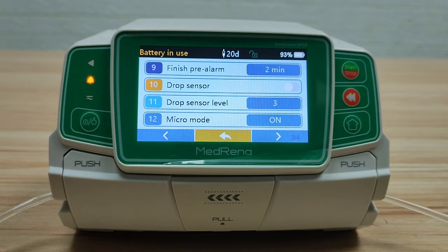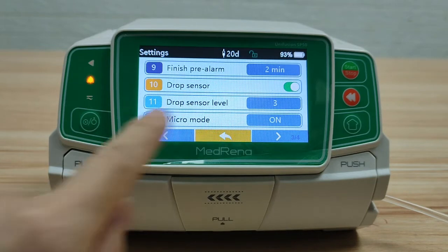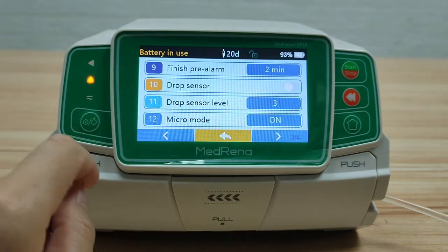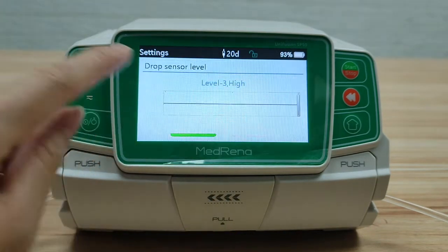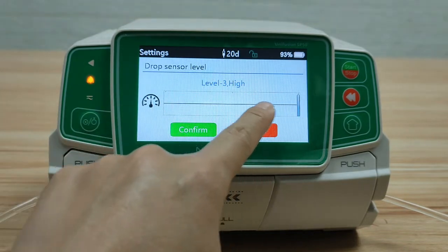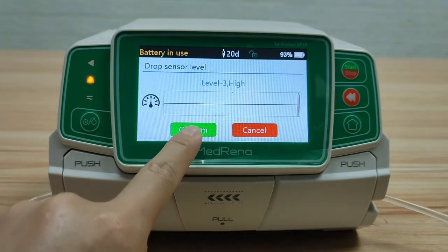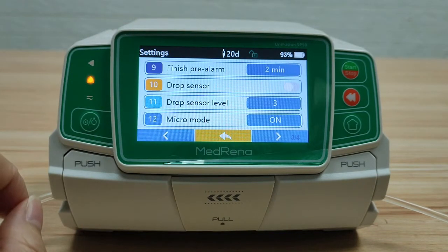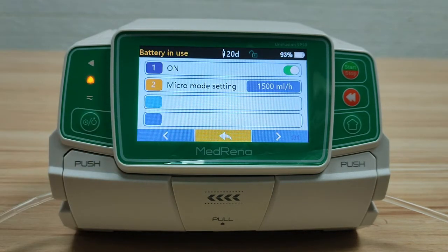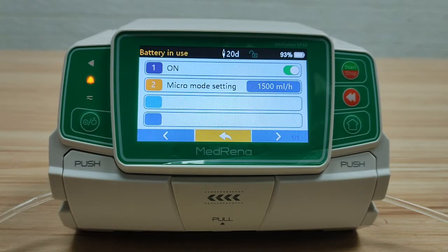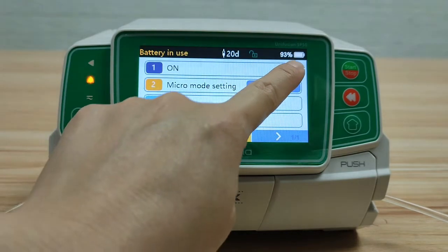When the drop sensor is in use, select Drop Sensor On. Drop sensor level: there are three levels for choosing. Micro mode: the purpose of micro mode is to increase infusion safety by setting a limit on the maximum flow rate. It is used more often in neonates and pediatrics. We can select it on or off.